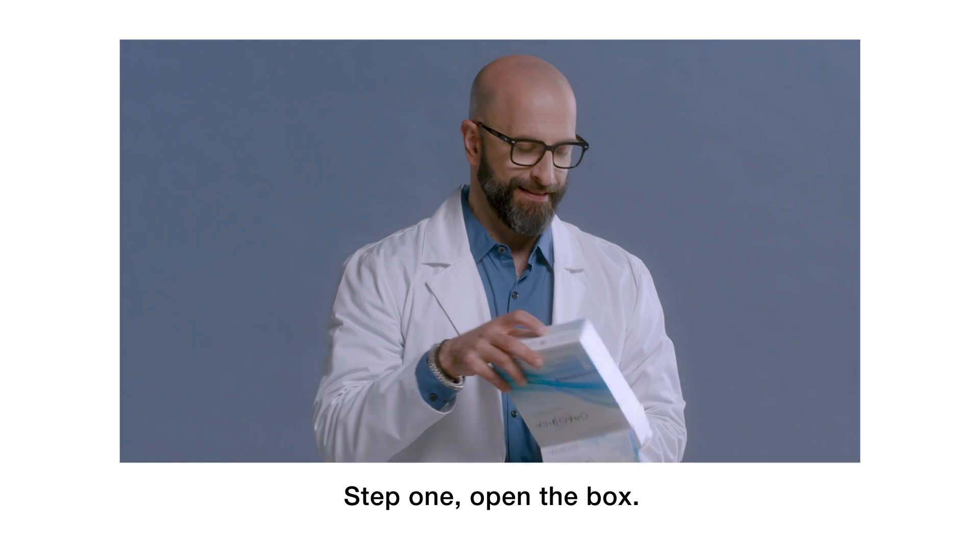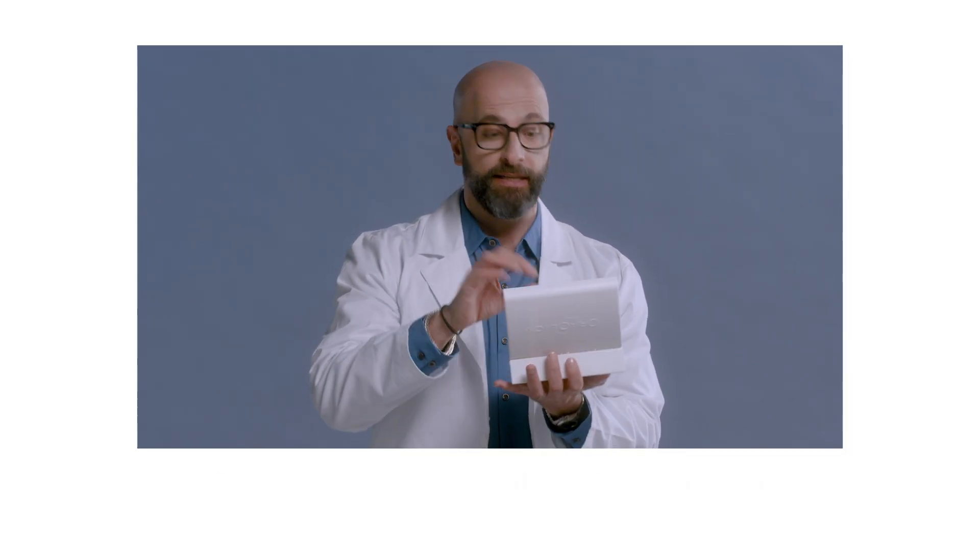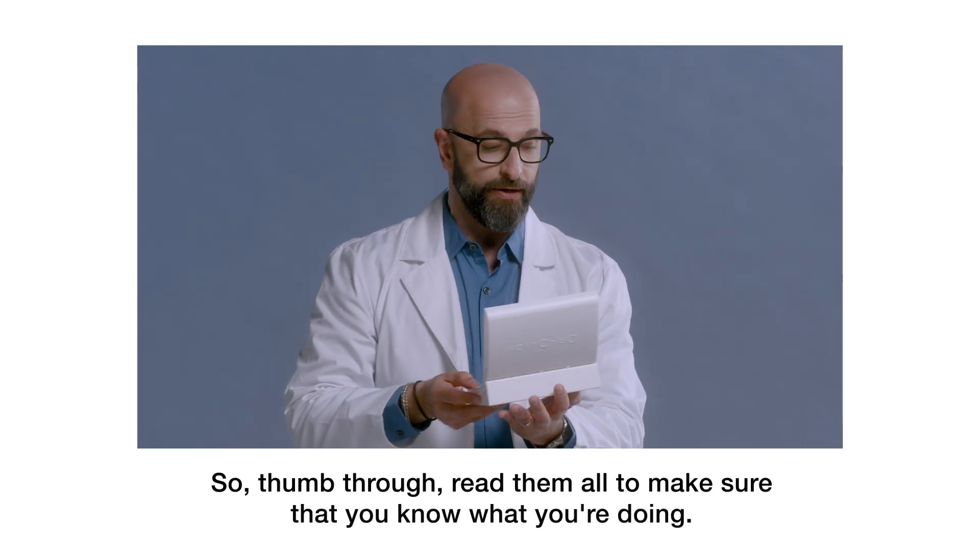Step one, open the box. Step two, always really important to take a look at all of the directions. So thumb through, read them all to make sure that you know what you're doing.